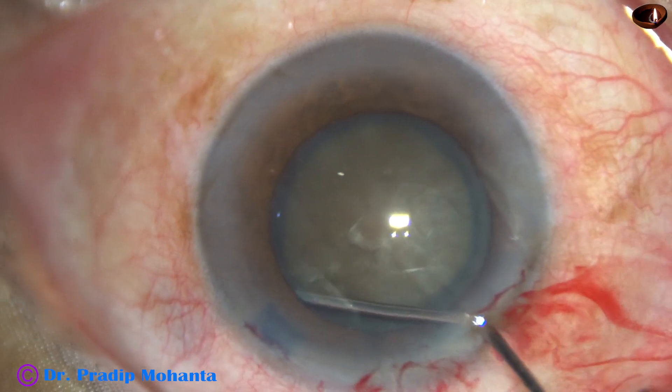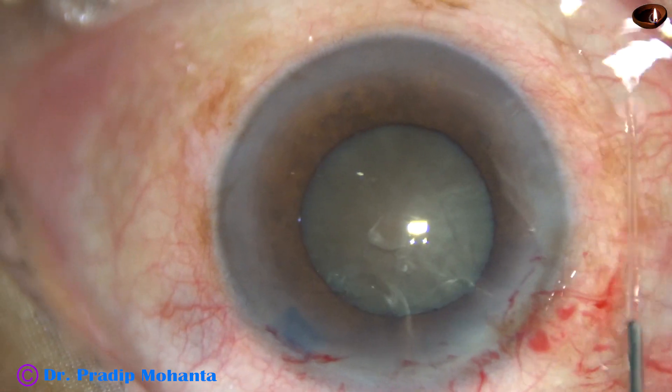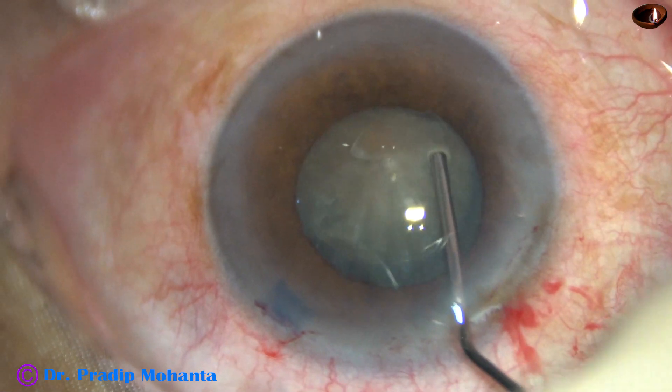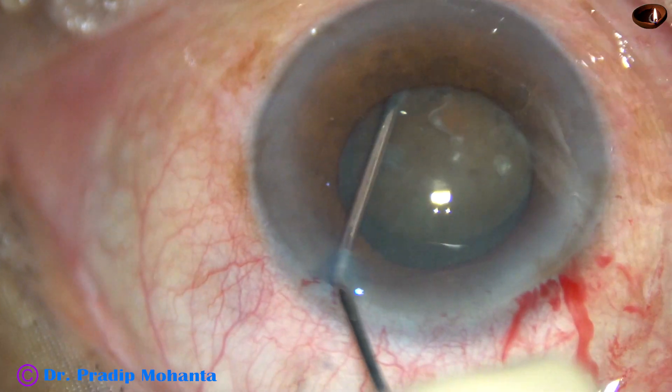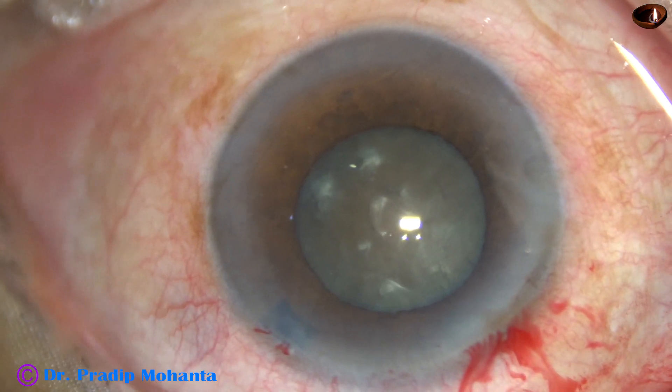Hydrodissection is being done. In hard cataracts, always inject fluid very slowly, very gently, and in multiple points. Mobilize the nucleus and rotate the nucleus.